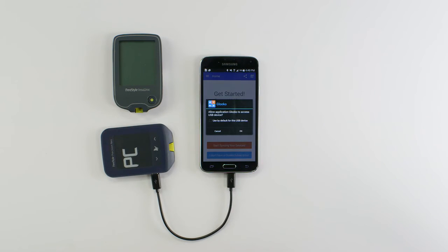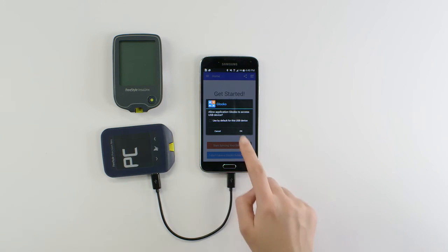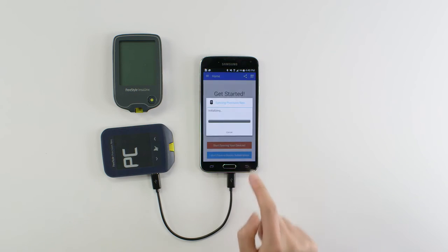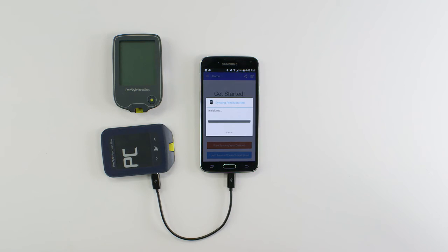Since Gluco needs access to the device's data via USB connection, you'll see a pop-up requesting that permission. Tap OK to allow the access and start the download.